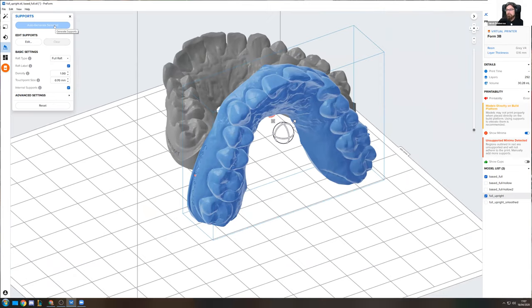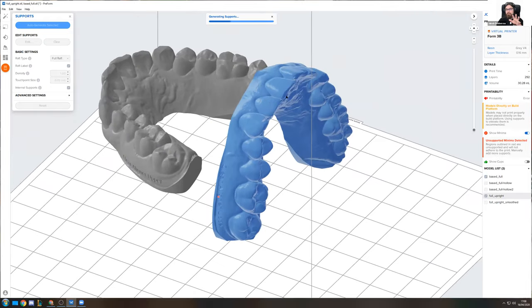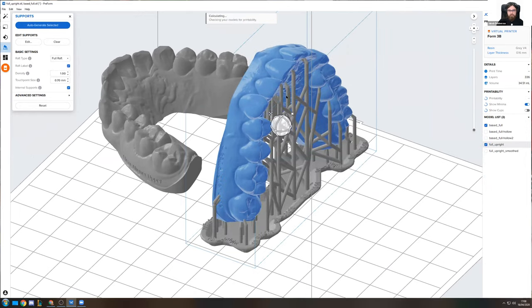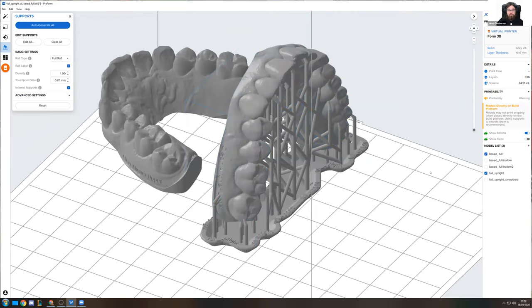If we just leave everything on standard, I can just auto-generate the supports for this one model right here. I can either click on a couple of specific models that I want supports to be generated on, or I can just click, like I did right now, on one model to have supports be generated. Or if I don't click on any of these models, I can just have supports be generated for all of these models at the same time.